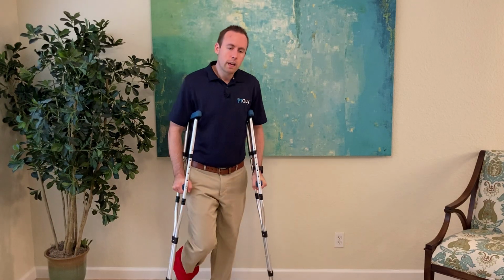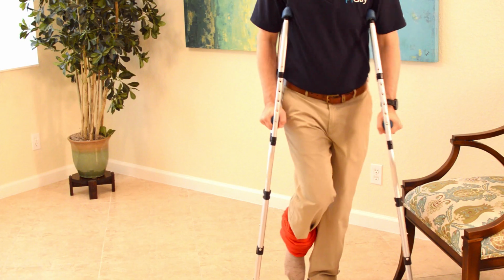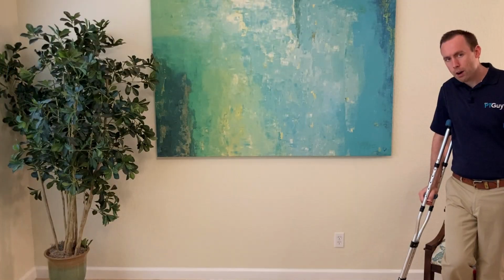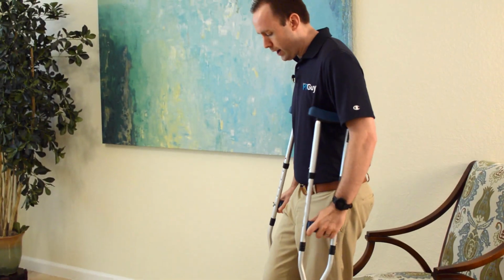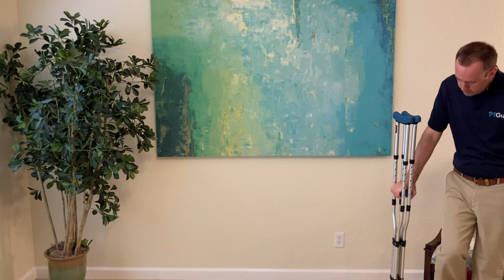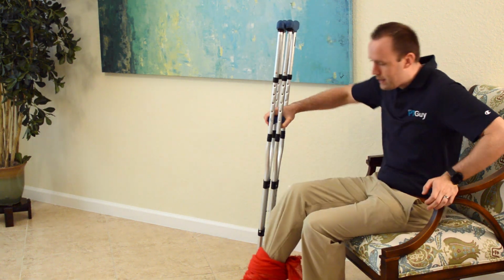Now, what happens if you need to actually sit down in the chair? Well, what you do is you come on over, okay? And then from here, you back up so that your good leg touches the chair, and then you need to take the crutches out and put them in one hand. Now, I generally like to keep both the crutches on the hurt side. I'm going to put them together like this, and I'm going to grab like this. Okay, that's basically making my other leg. And then with my other hand, I reach back for the armrest, and then I sit down like that.